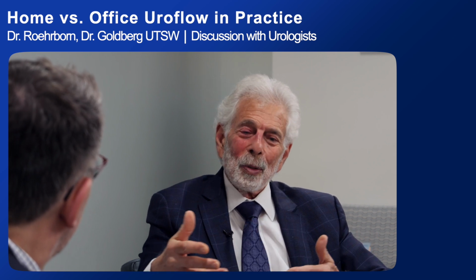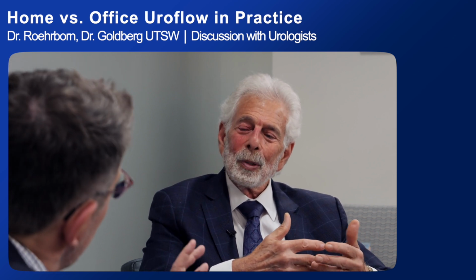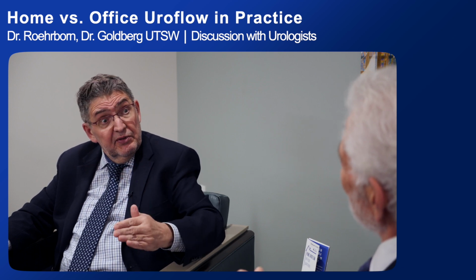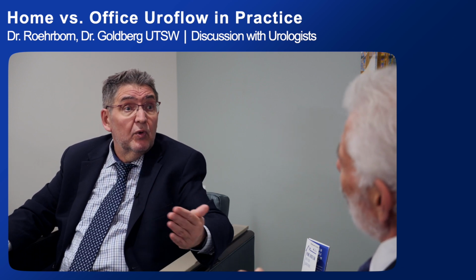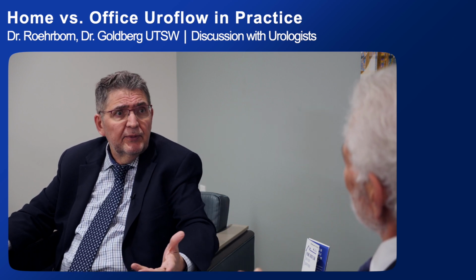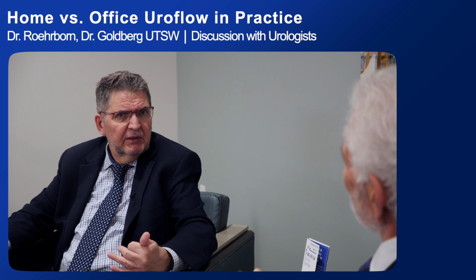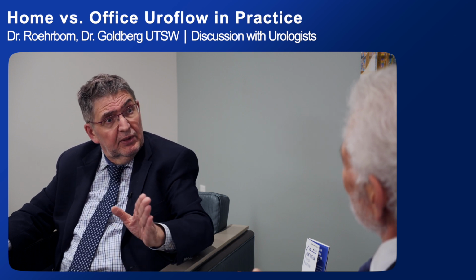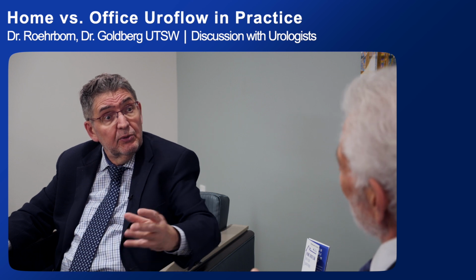So I found another interesting, intriguing piece of information. Not yet any therapeutic responsiveness studies, but they're easy to do, before and after treatment, before and after surgery. Or let's just take an example. A patient has a stricture, and let's say we dilate the stricture. It's always risky because it could stricture up again, the scar could reform.